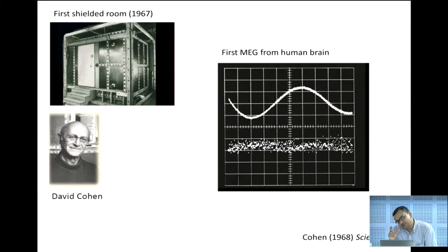So you can see here one cycle, the alpha cycle, but that's just one cycle. He needed almost 10 minutes of data. Why? Because the signal is very weak, buried in noise, so you need lots and lots of repetitions. Then after having lots of repetitions, you average, and only then can you extract the signal of interest. Down there you can see the signal trace, which is pretty much noise. Nevertheless, as a technical achievement it was very impressive, but the whole recording was cumbersome.